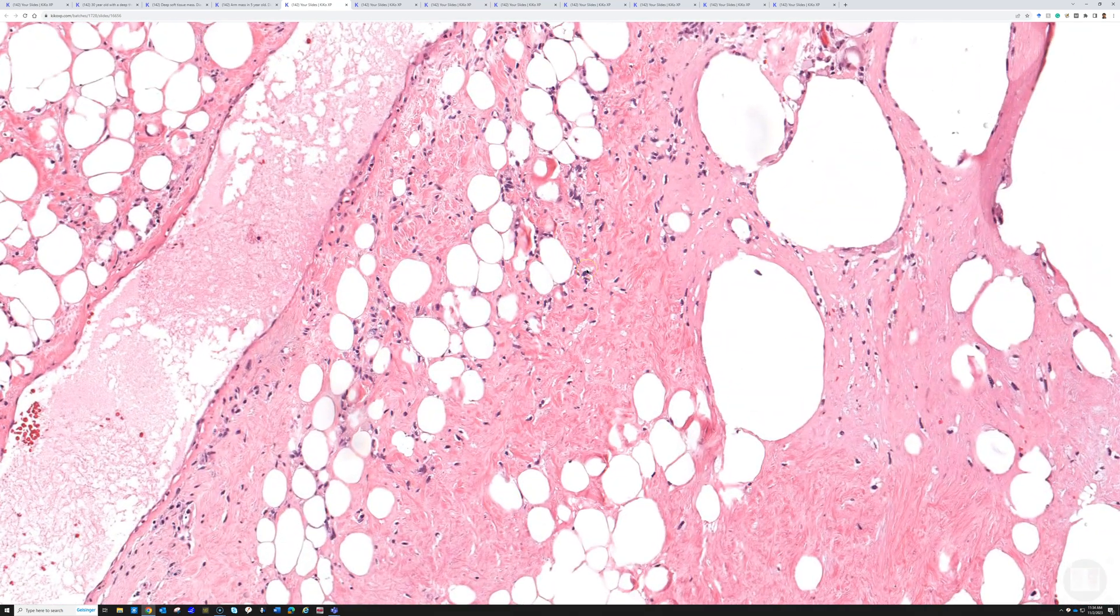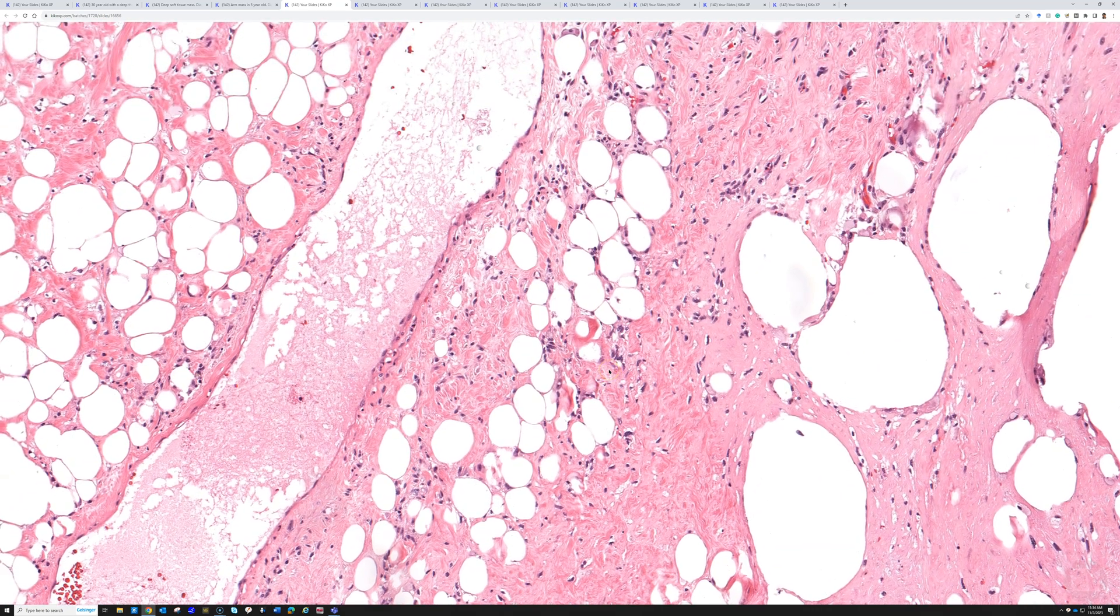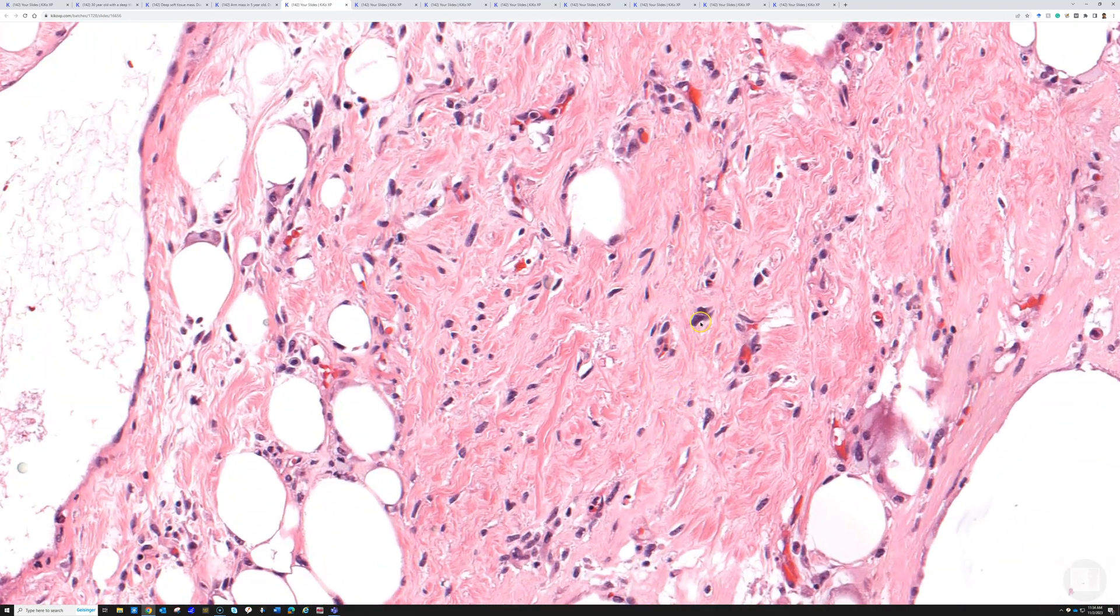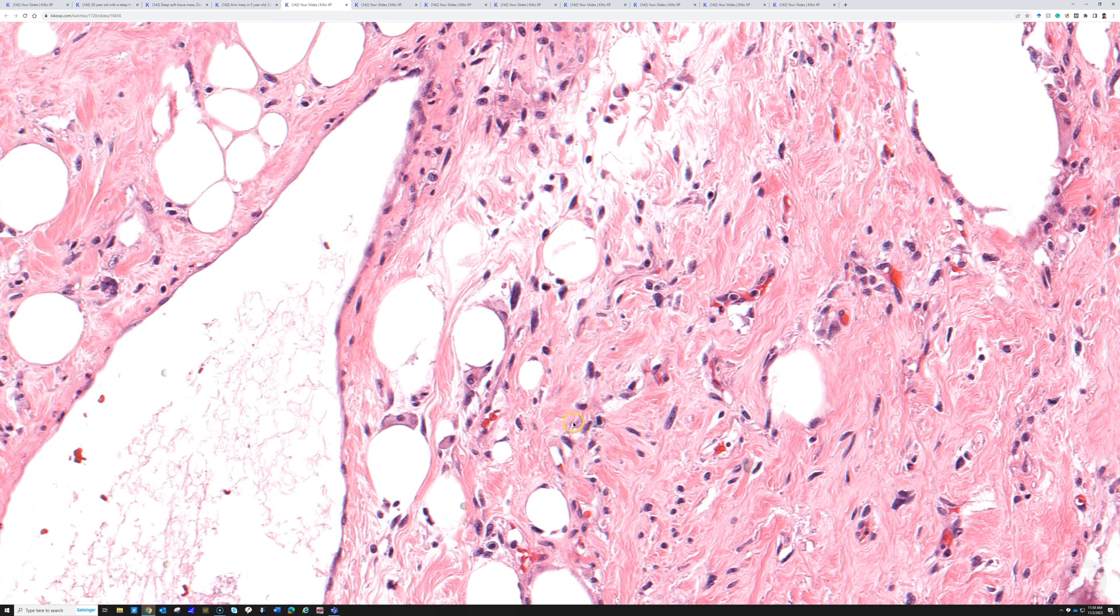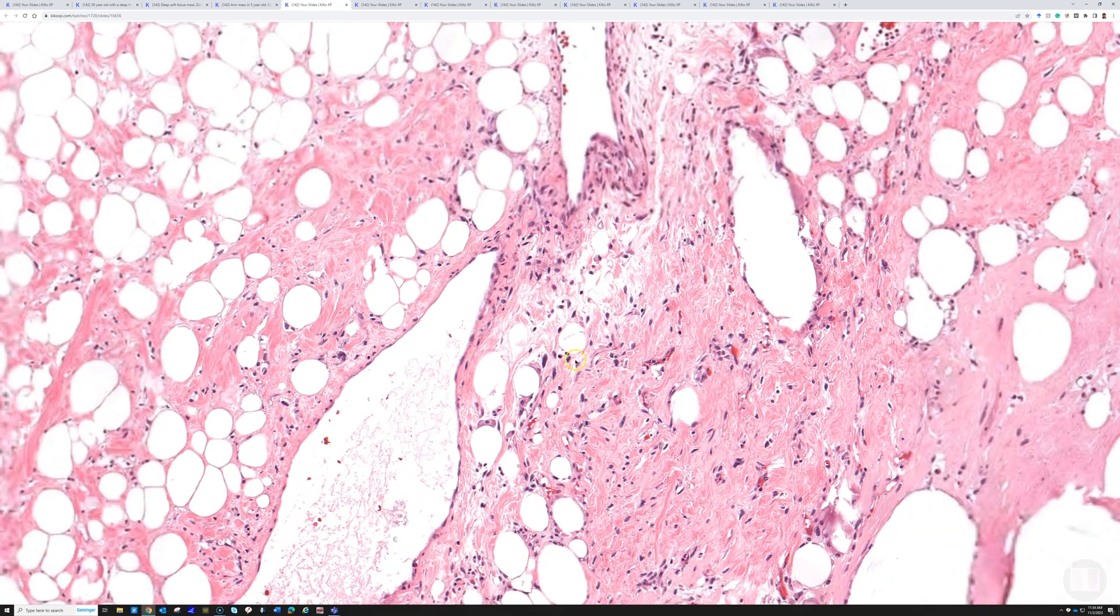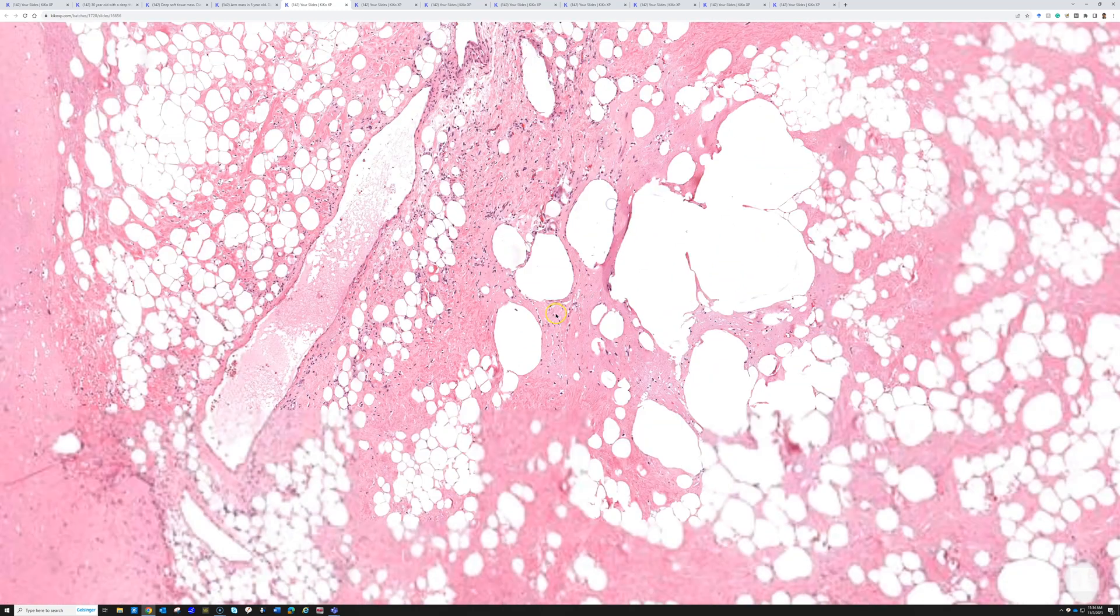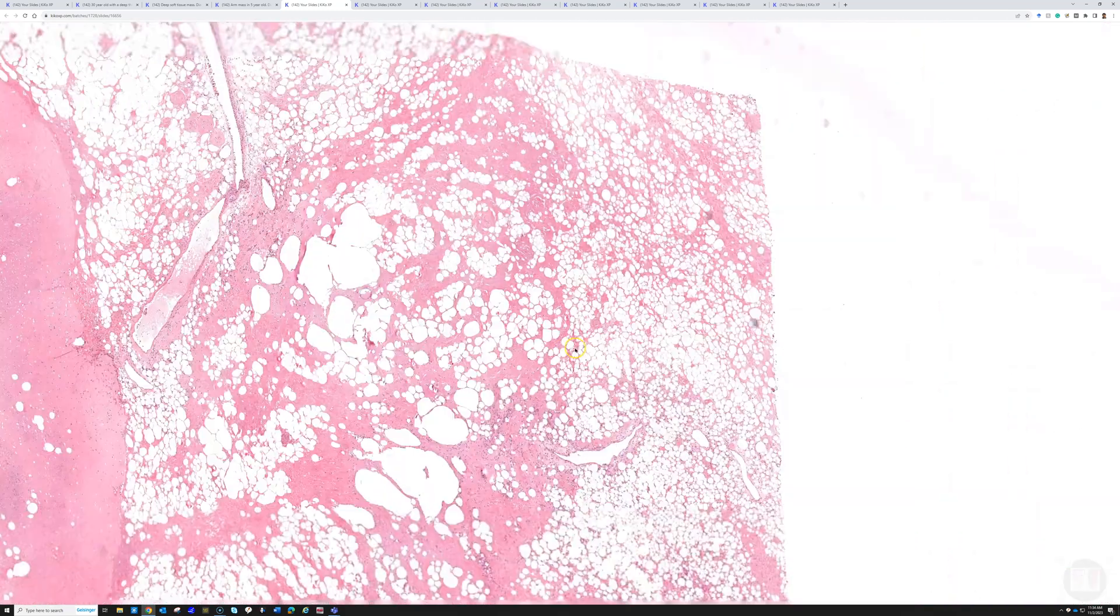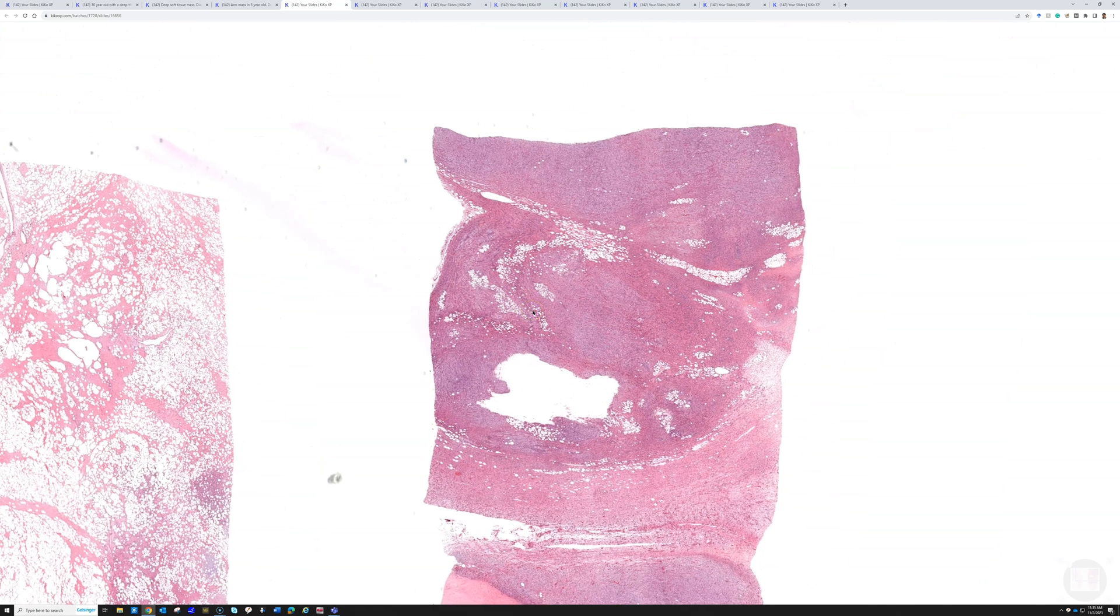All of those components can vary, and not every case has all of them. But this case is reading the textbook, so to speak, with hyperchromatic atypical cells, sclerotic collagen, and mature fat. When we have well-differentiated liposarcoma with any high-grade sarcoma component, by definition, that's de-differentiated liposarcoma.